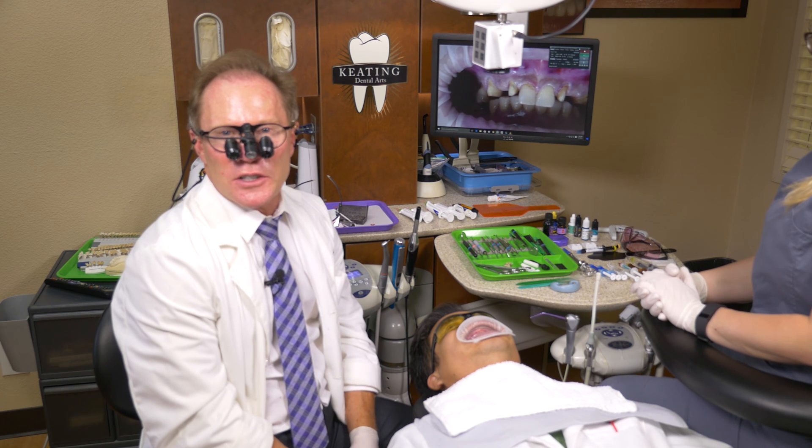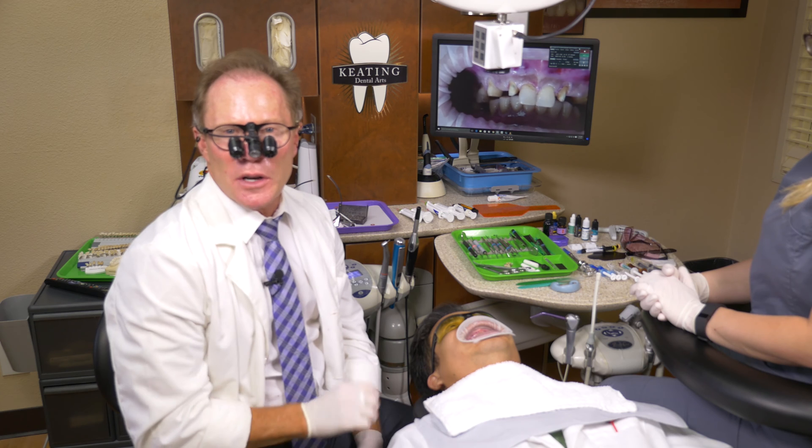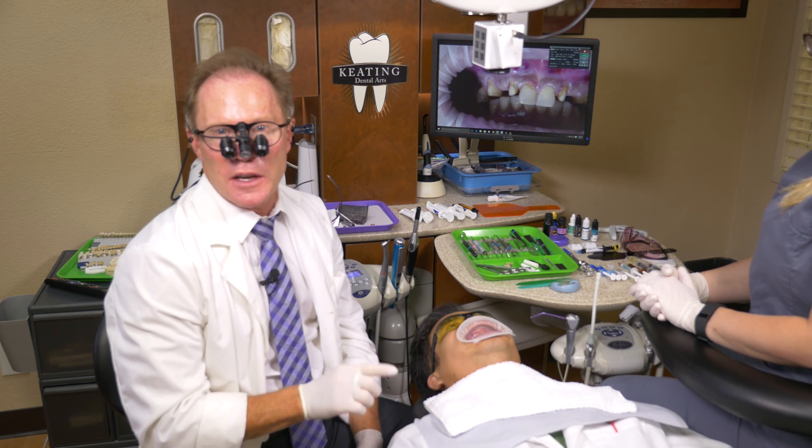Hello, I'm Dr. David Hornbrook, Clinical Director of Education and Technology here at Keating Dental Arts. Today we're going to do a procedure called an ovate pontic.